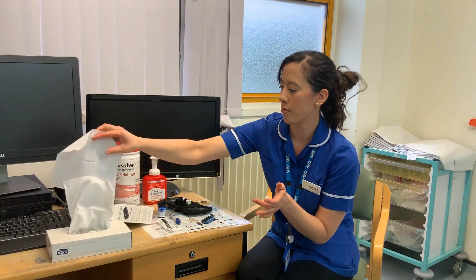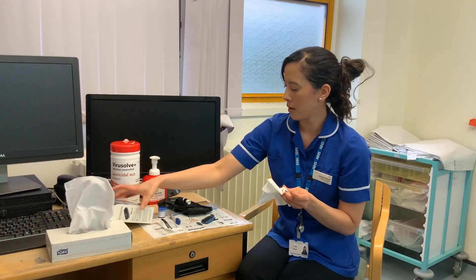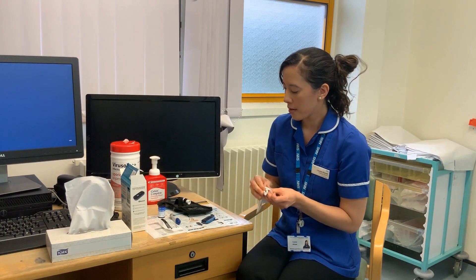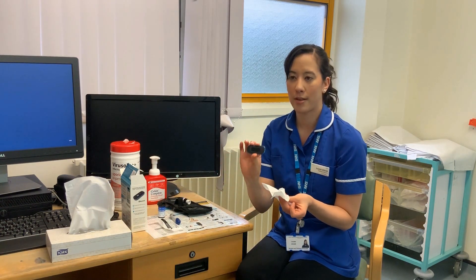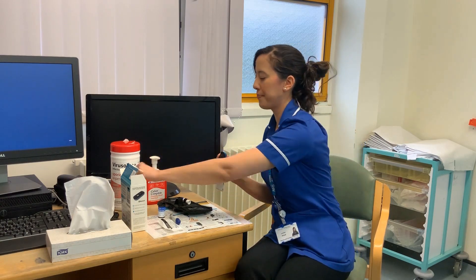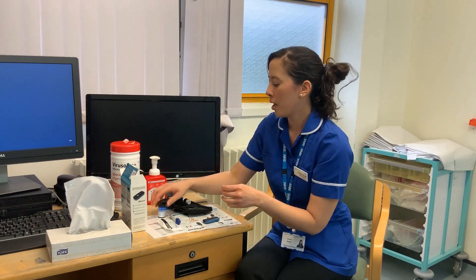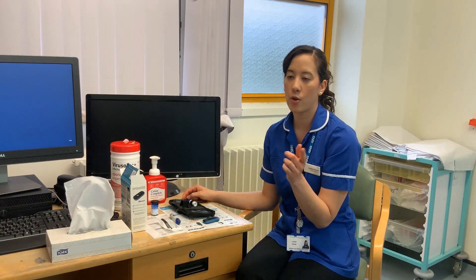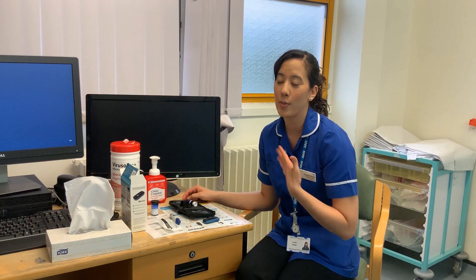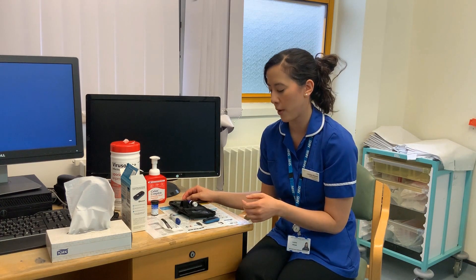Within a few seconds it will give you a reading. Once you've got your reading, you can pull the strip out with your tissue. The machine will turn itself off and you can pop that in the bin. The reading will be sent through to the app via Bluetooth, and in your pack you'll have a leaflet on how to do that. We will also go through that with you over the phone.